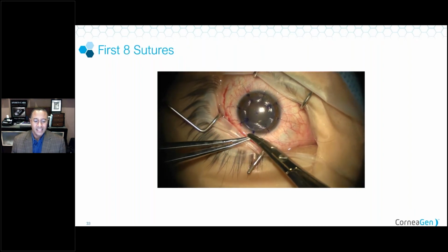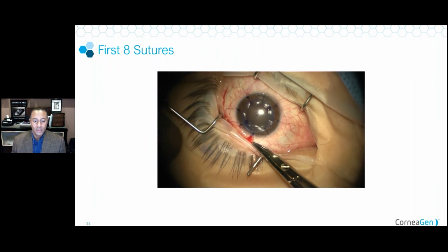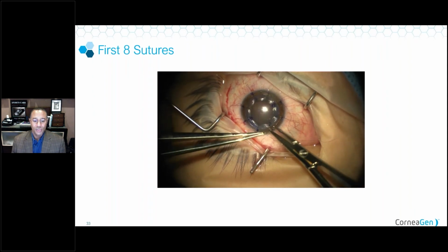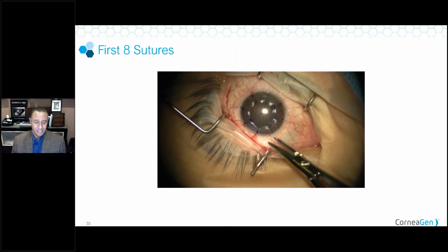Here I've got in 7, we're placing the 8th. So we go from a nice square to an octagon. Again, you can see that stria. And as we pull in that last suture, we lock it in place. I always do 3-1-1 knots.